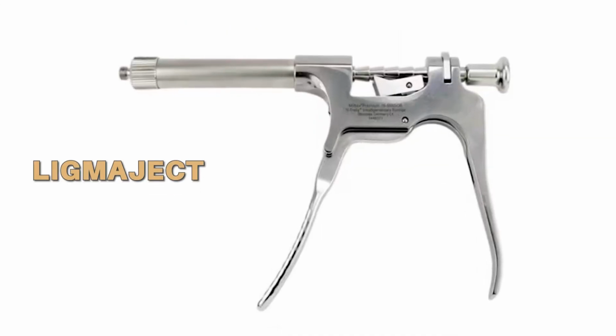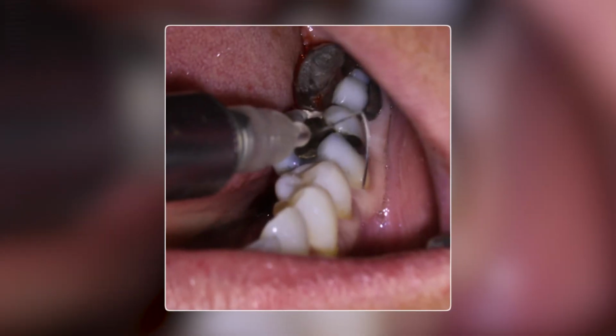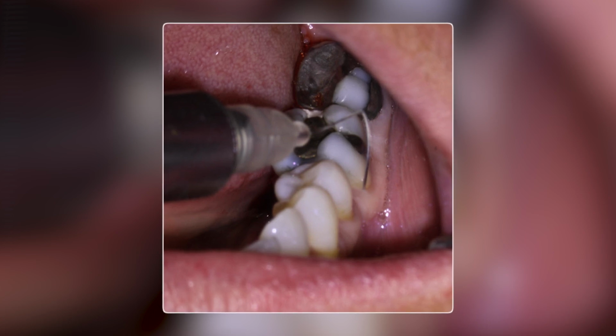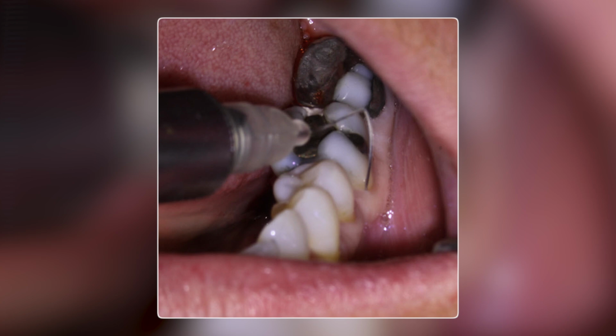At one time, I was using a dedicated device, such as a Ligmaject, to provide the pressure necessary for this injection. This has the advantage of being a little easier on the hand, since a lot of pressure needs to be exerted on the syringe to get the correct pressure to allow the anesthetic to be forced into the PDL. However, with more experience, I realized that by applying the necessary pressure with a standard anesthetic syringe, I could basically achieve the same result.